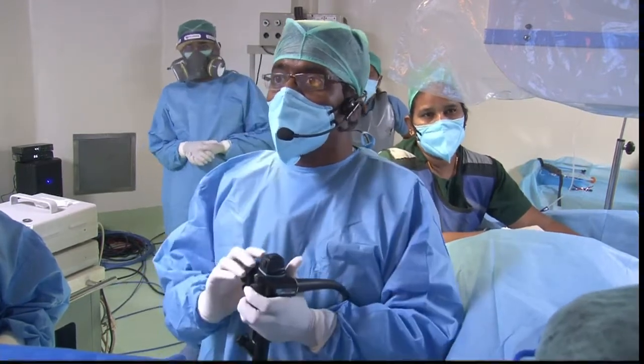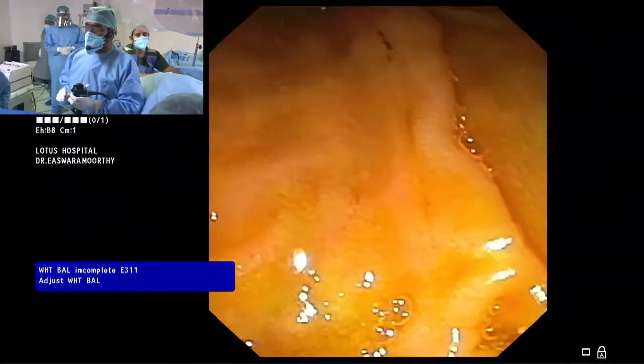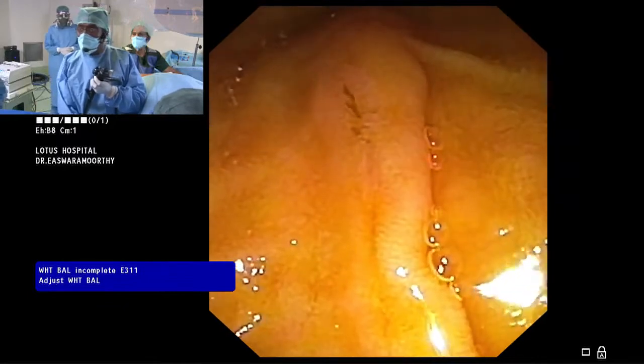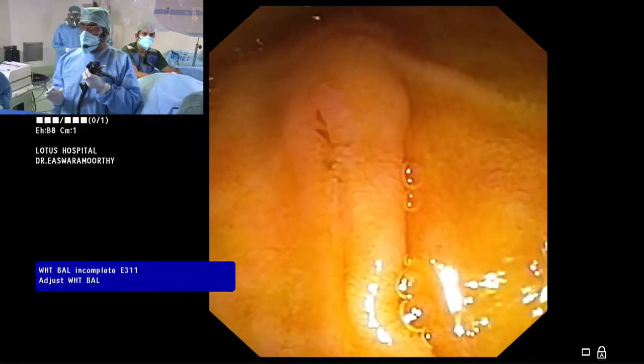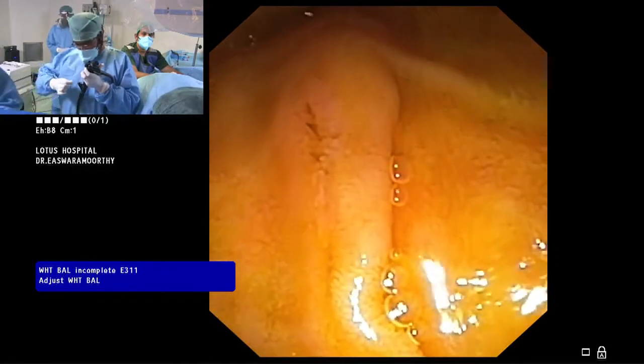See now, I am just. Can you see now the ampulla is staring at you? What you are seeing is a very small ampulla, and that is right at the middle. Can you see it now?